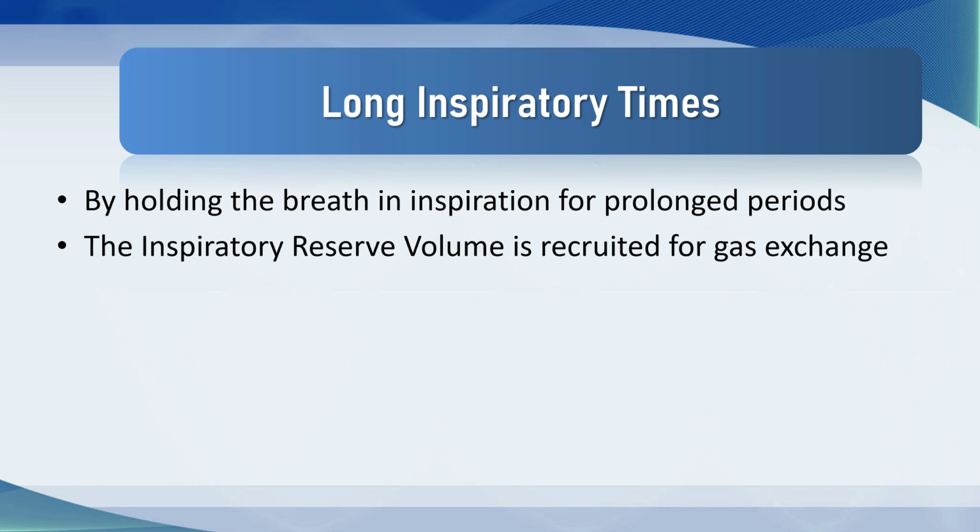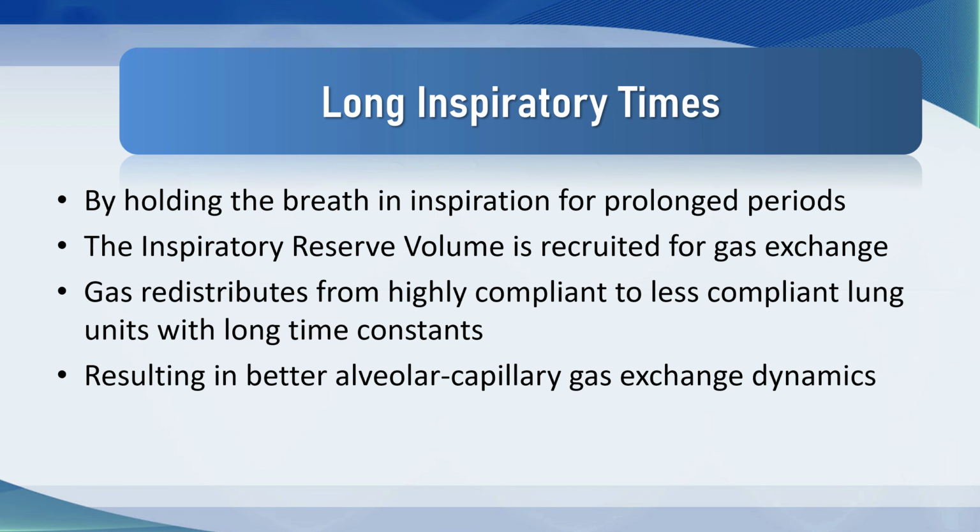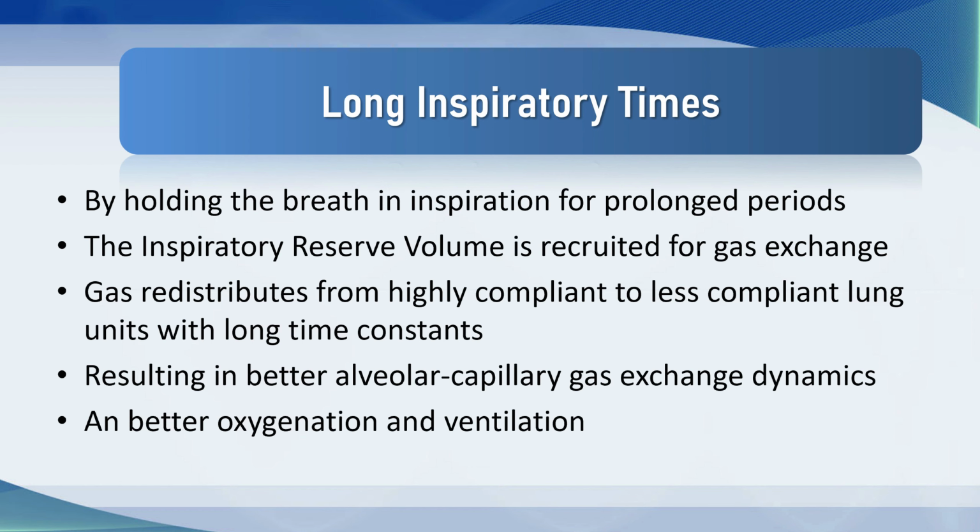Gas redistributes from highly compliant to less compliant lung units with very long time constants, and this results in better alveolar gas capillary exchange dynamics and usually better oxygenation and ventilation in very, very diseased lungs.